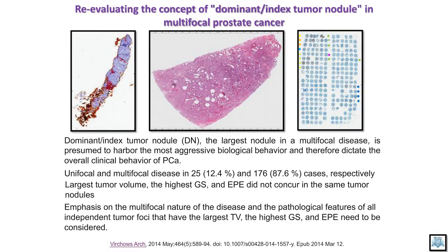So when you have a prostate cancer with more than one tumor foci, we are asking whether these individual tumor foci are genetically identical or different. Okay.